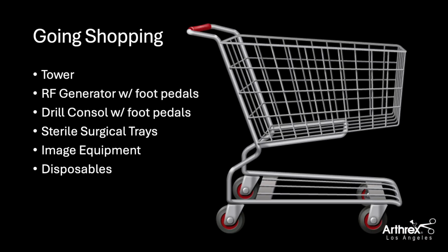Now that we understand what time to be at the case, 6:45 for a 7:30 case, and also the setup if it's a right side pathology or a left side pathology, we also want to make sure we get to the rep storage area for our RF generator console, our foot pedals, as well as our drill console, and we also want to make sure that we have all of our disposables that we'll be taking to the room.